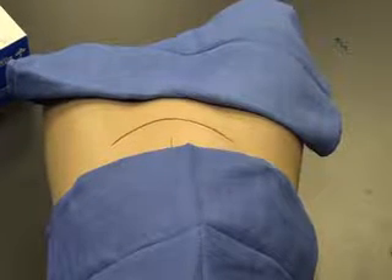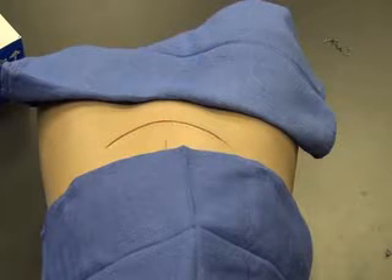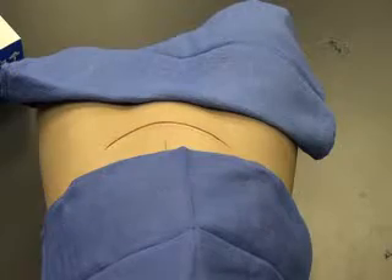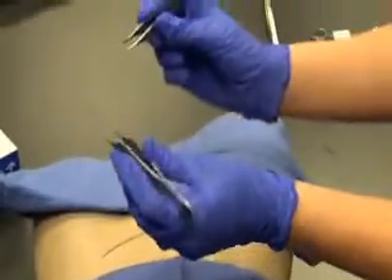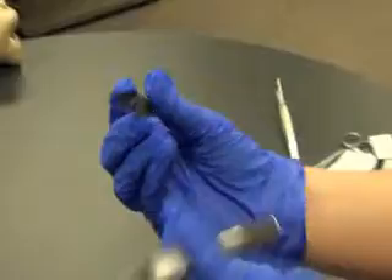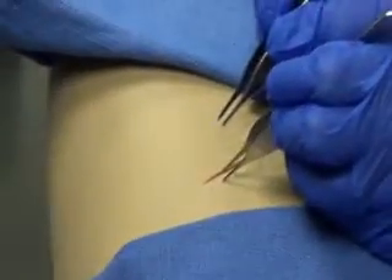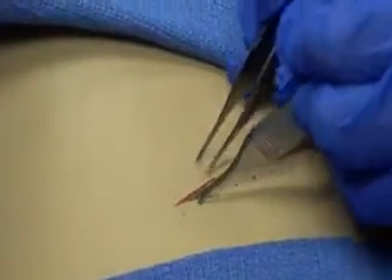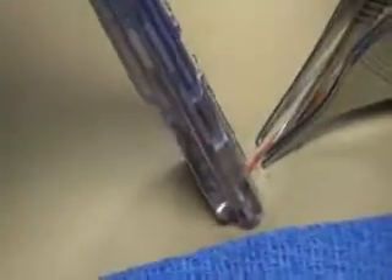We're going to show you how you would close the patient with a stapler. You're also going to assist the surgeon as he does it. Notice that she's going to have two Adsons with teeth. You grasp the edges of the skin and hold them together so that the surgeon can staple.